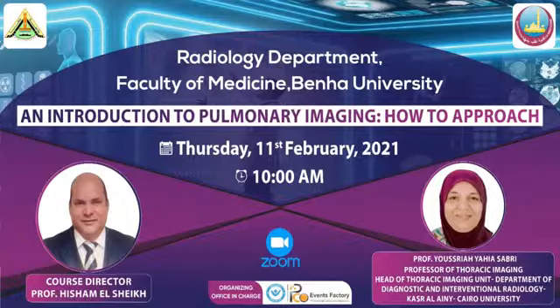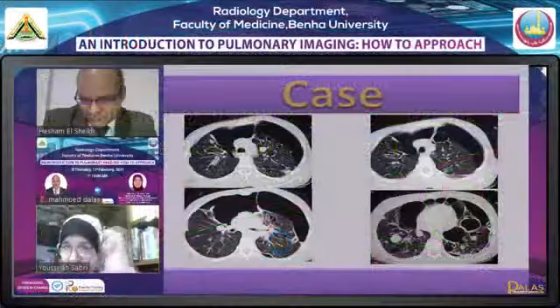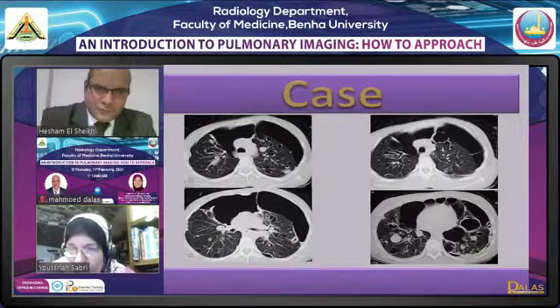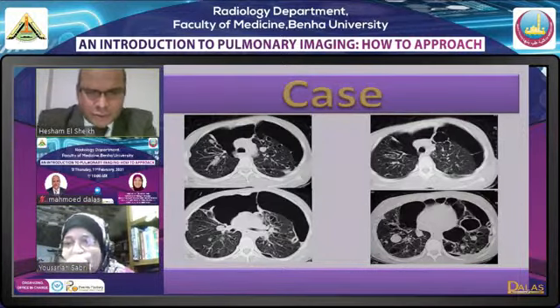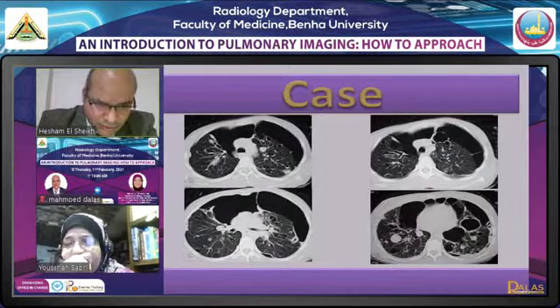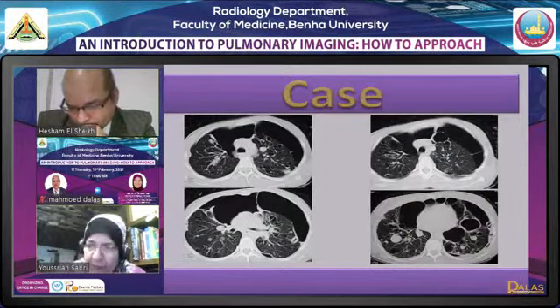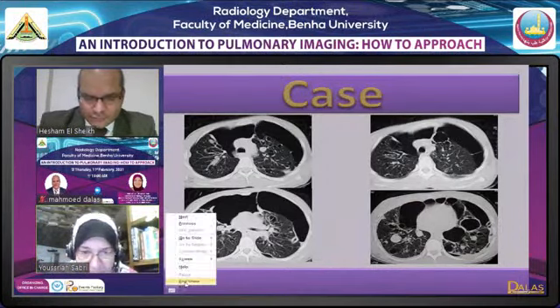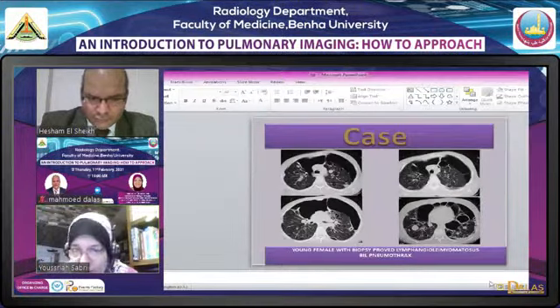عشان افرق سنترال ماس عامل اوبستراكشن ونتيجه لهذا الاوبستراكشن في كونسوليديشن في لانج كولابس او كونسوليديتد او وات ايفر لانج لازقه في هذا الماس، الحل الوحيد ان اعمل يا بيت سي تي يعمل ديفيوجن ايمج. Another question: how to suspect atypical infection on I think this an X-ray or CT atypical infection. طيب هوريكم حضرتك، هرجع لحاله هنا كده وهقول لحضرتك امتى consider atypical. Let us see here.